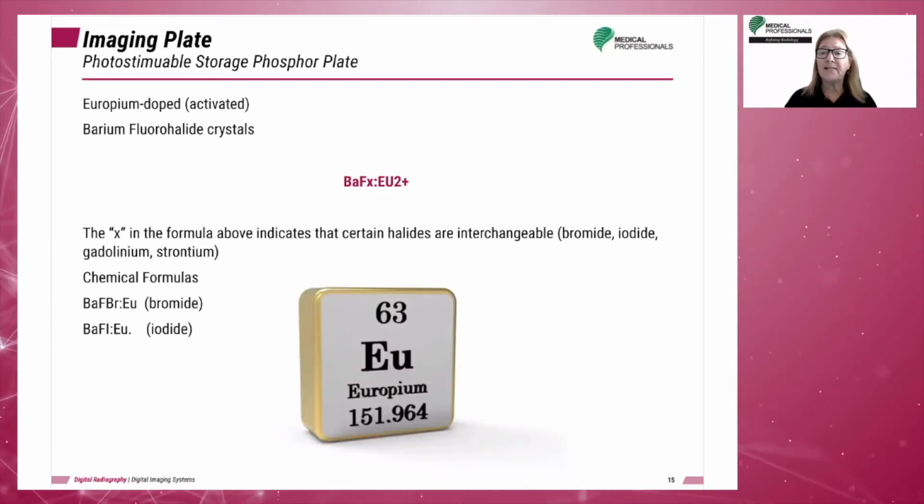Europium is a silvery rare earth metal used as an activator for the phosphor. Europium captures some of the energy of the remnant X-ray beam. It is responsible for the phosphor's ability to store energy.